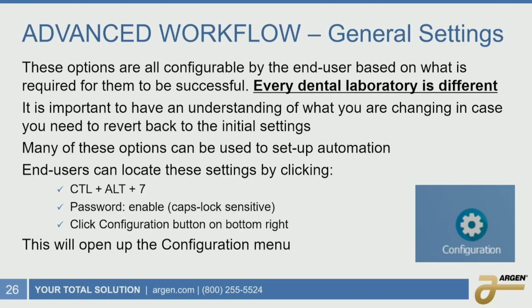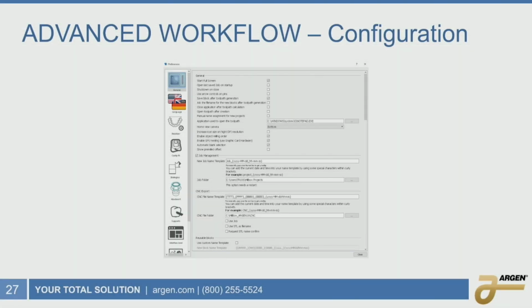When you do that, this icon here is going to show up in the bottom right-hand corner. In 2019, this icon will already be there, but you'll have limited options. Basically, you can change the language. Now when we go in there, we're going to see a whole list of other options.